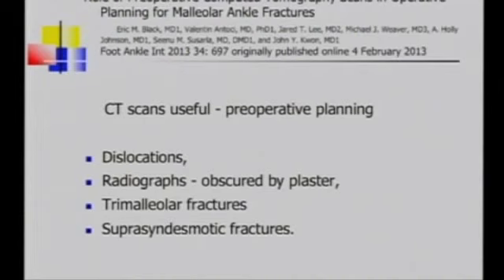Now, let us see about this article. It is a 2013 article that talks about the value of CT scan in assessing the geometry. They say that it is particularly helpful in dislocations, and particularly when there are trimalleolar fractures or we suspect a syndesmotic injury.